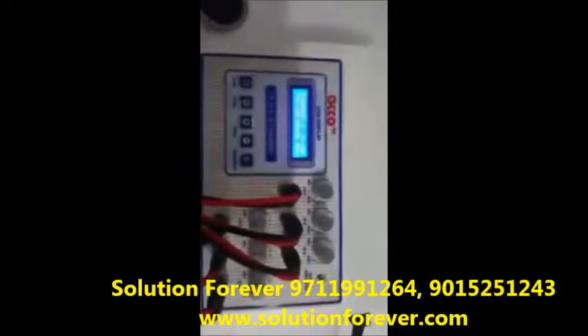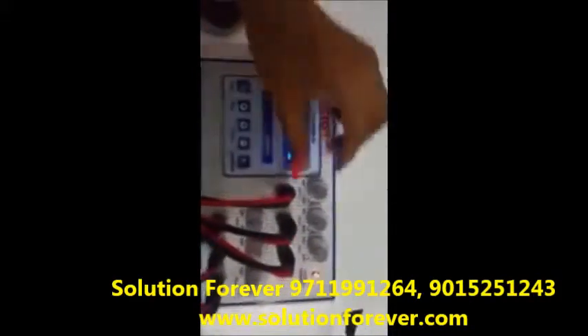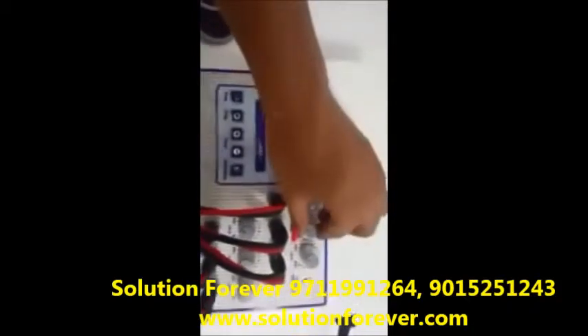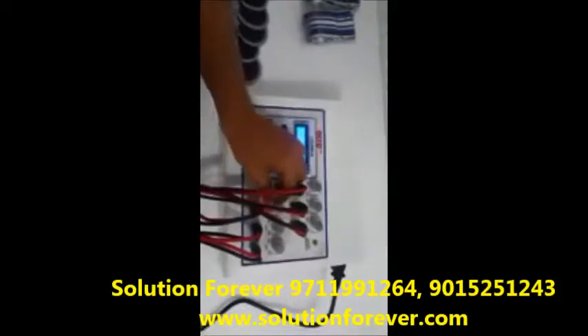After setting all the parameters, press the start button. Now increase the intensity as per your need across Channel 1, Channel 2, Channel 3, Channel 4, and Channel 5.